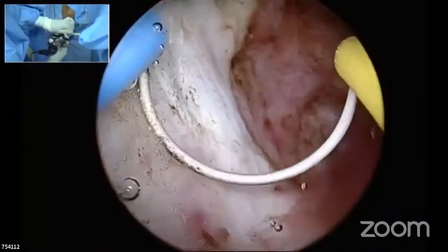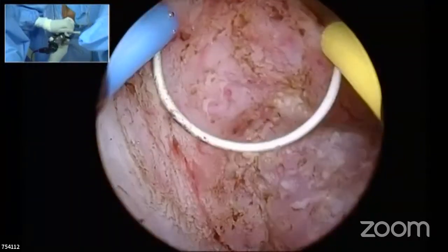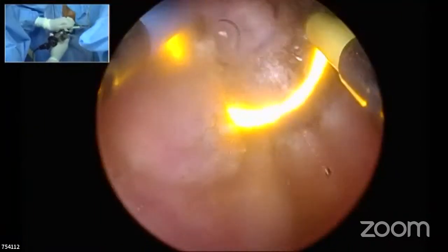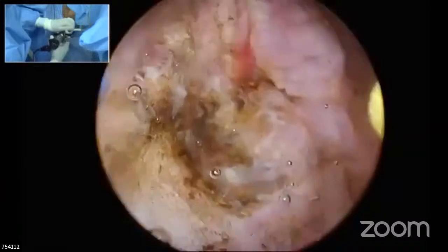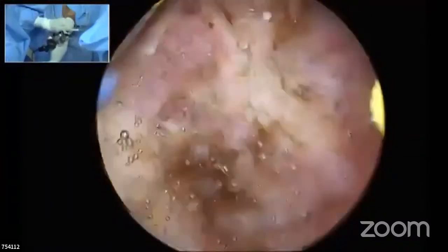There was a muscle contraction here. It appears as if there is a projection, but still I don't want to resect it because this muscle contraction was there. So be careful of resecting that area. Another muscle contraction may allow you to go outside the capsule. So that is what we need to look into.